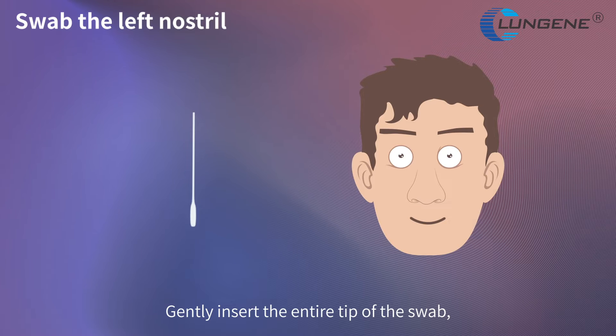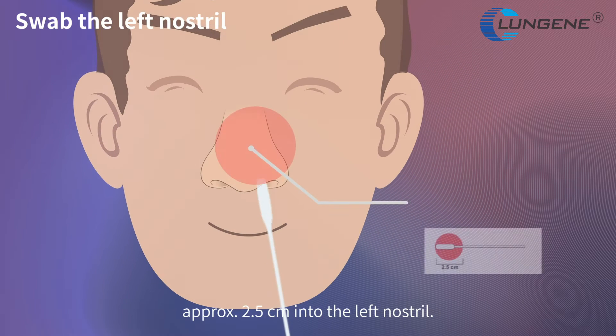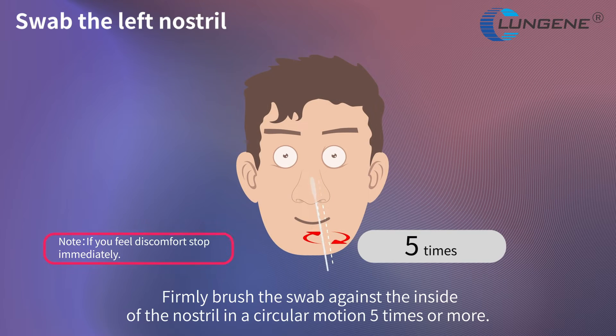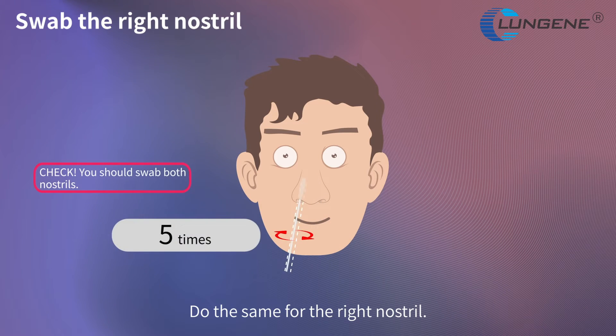Gently insert the entire tip of the swab approximately 2.5 cm into the left nostril. Firmly brush the swab against the inside of the nostril in a circular motion 5 times or more. Do the same for the right nostril.